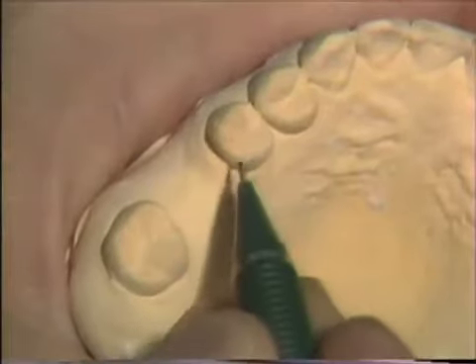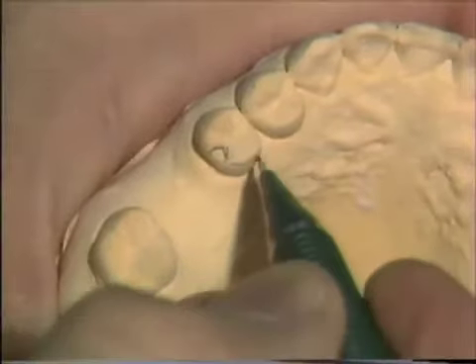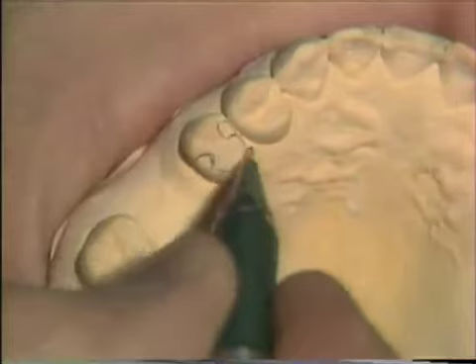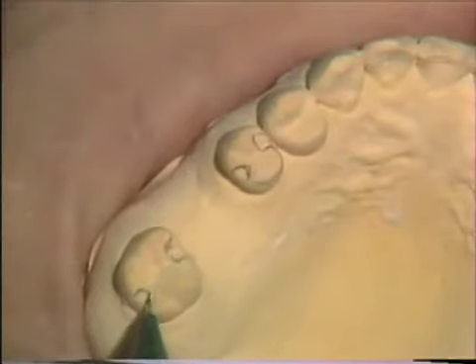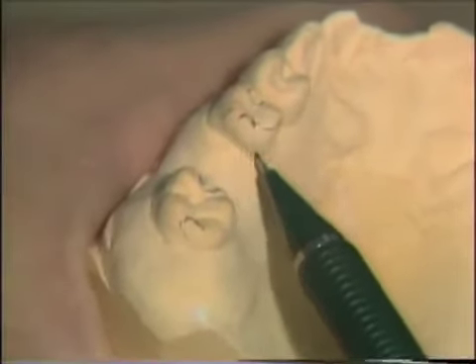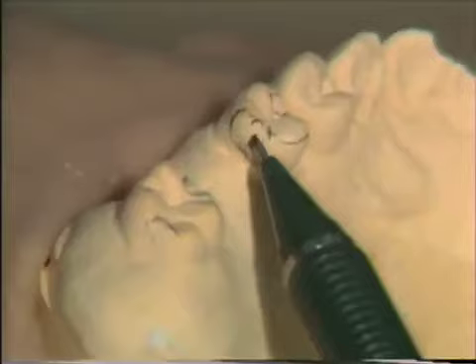From the occlusal, what we're going to do is have a rest on the distal marginal ridge. Since this is a supporting cusp, we won't be involving that. We'll be coming up and into the mesial marginal ridge, and on the molar we'll have a stop on the mesial marginal ridge and the distal marginal ridge. We are going to make a slice that'll come out fairly far, because we need a wrap around of this area. This slice will not show from the mesial, but we get around the tooth enough for a sufficient grasp. We're going to place a slight groove in the middle of the distal slice.